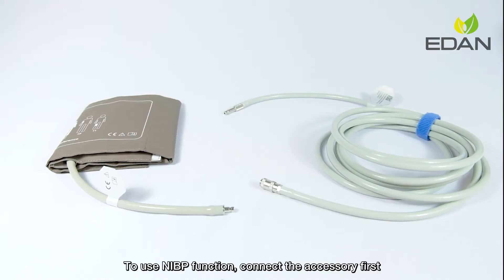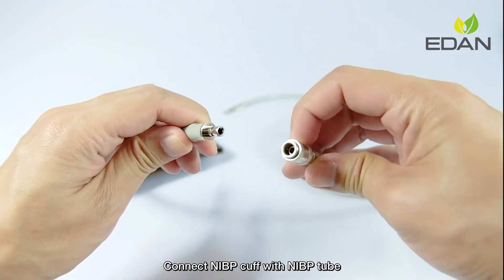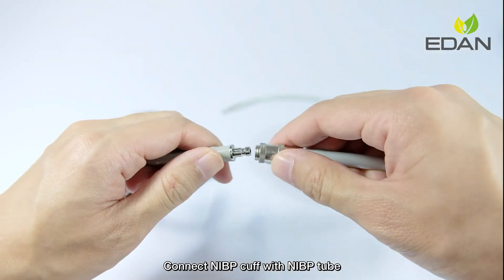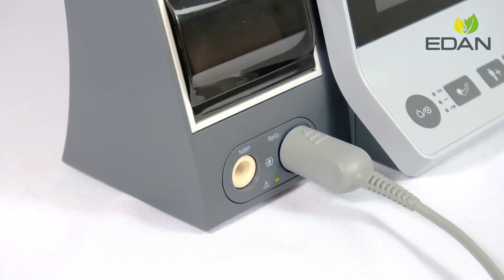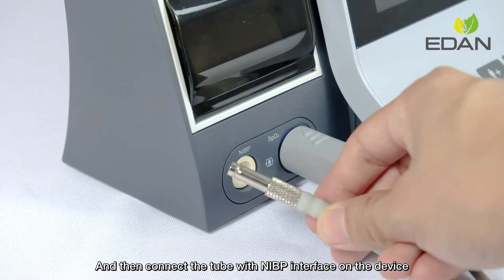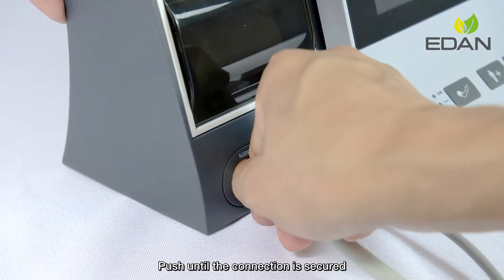To use the NIBP function, connect the accessory first. Connect the NIBP cuff with the NIBP tube. Slightly push the sockets to connect, then connect the tube with the NIBP interface on the device. Push until the connection is secured.